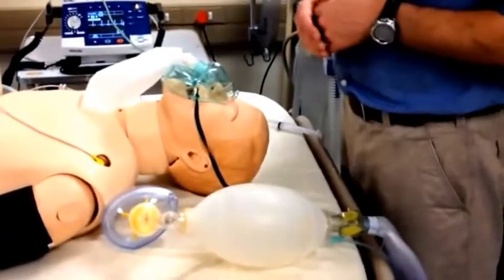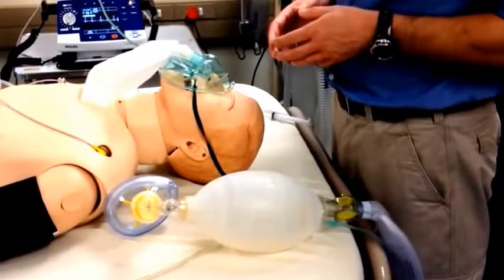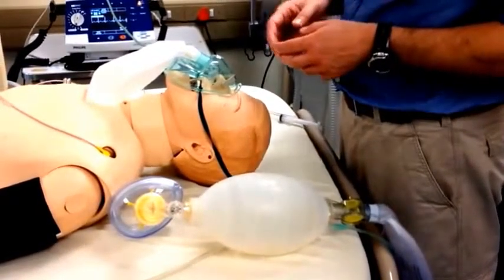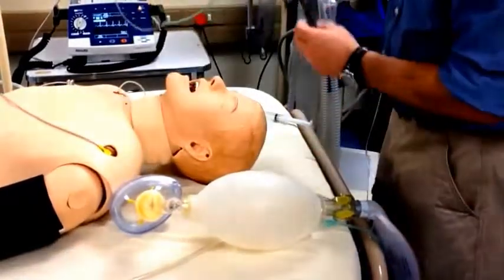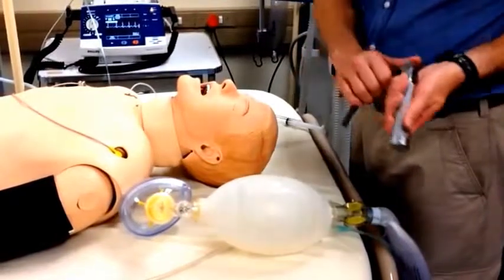Keep your oxygen source on the patient, but without actively breathing for them, and await sedation and paralysis to be complete. Once the patient is paralyzed, remove the oxygen mask or other oxygen source from their face. Take the laryngoscope in your non-dominant hand.